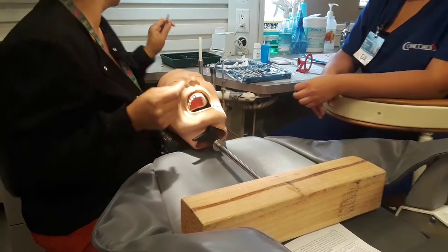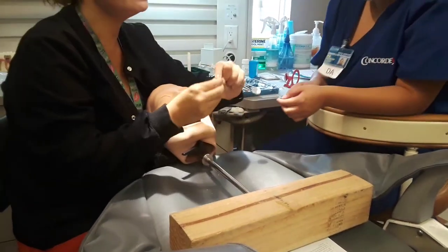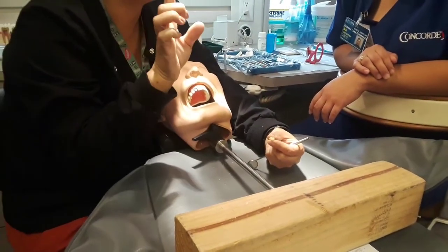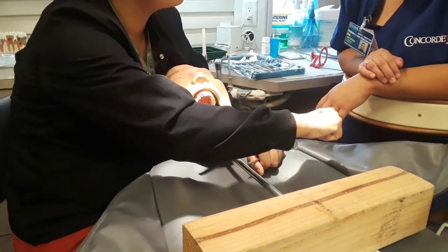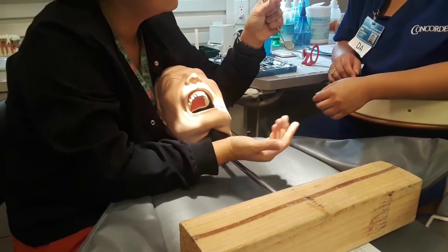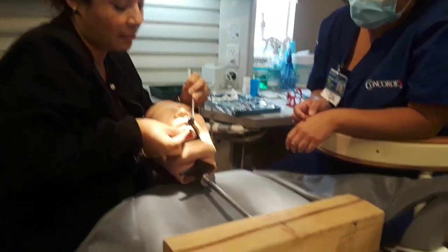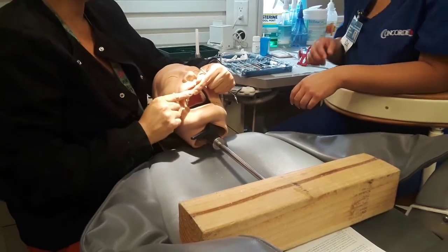Try on permanent crown. This is a mandible tooth — this longer portion is the buccal, the shorter portion is the lingual. Wherever we're working, you should know the facial and lingual for eight and nine. You want to pass it so it's easy for me to grab — pass like that instead of pinching it, because if I pinch it I could take your glove. I was always taught to pass on the back of my hand so I can pick it up in the direction it's going. Pass the floss — why? To check the contact.